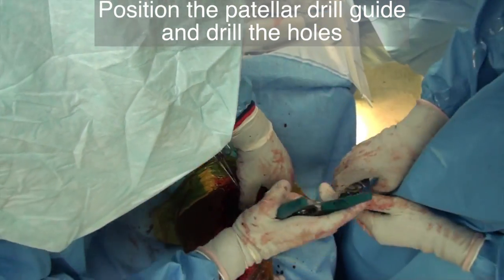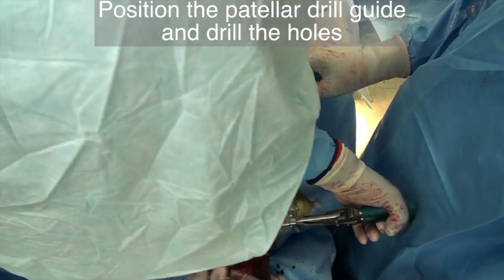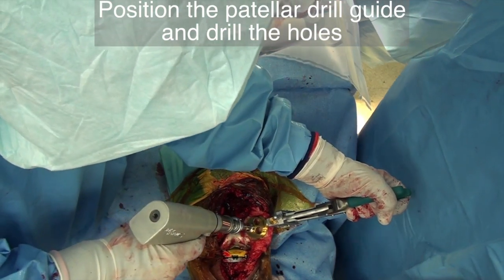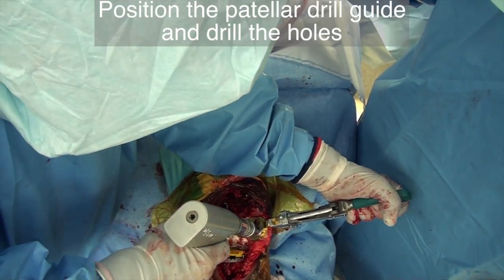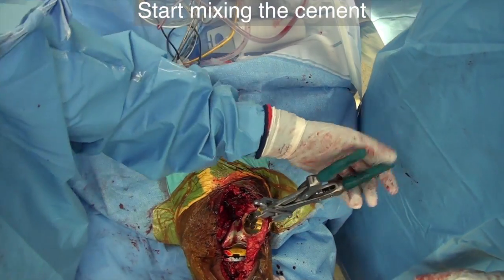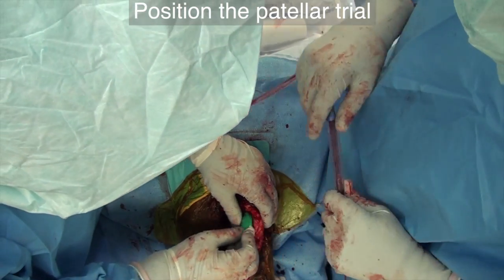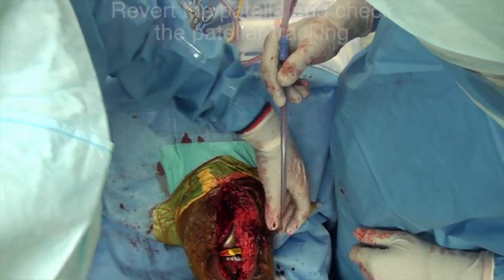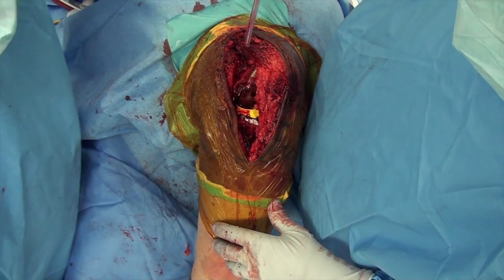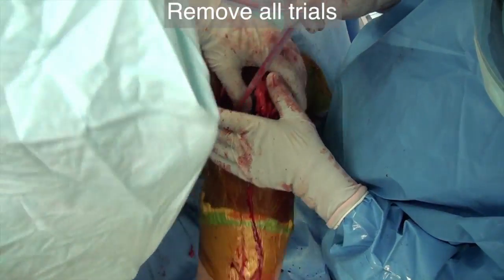Position and size the patella drill guide and drill the holes. As we finish drilling the holes in the patella, we start mixing cement for the entire prosthesis. Apply the patella trial. Revert the patella and check the patella tracking. Once alignment, stability, and tracking are confirmed, remove all the trial implants.